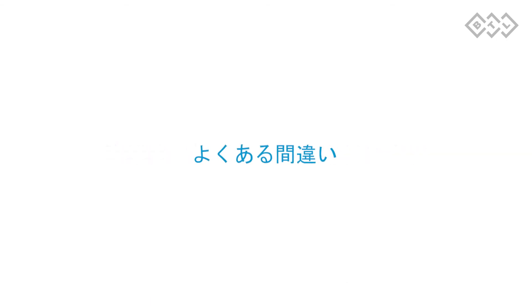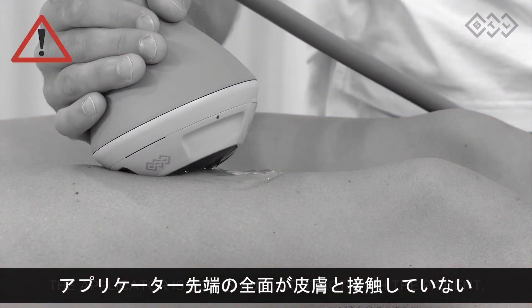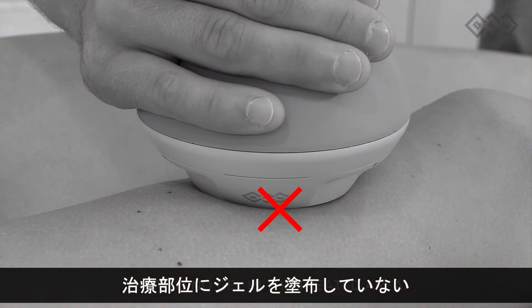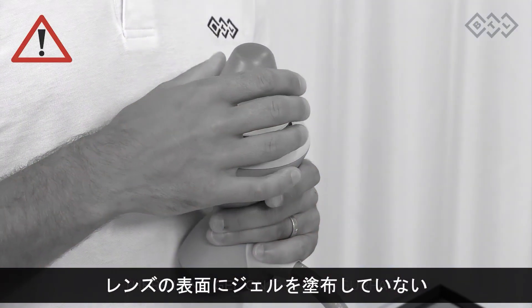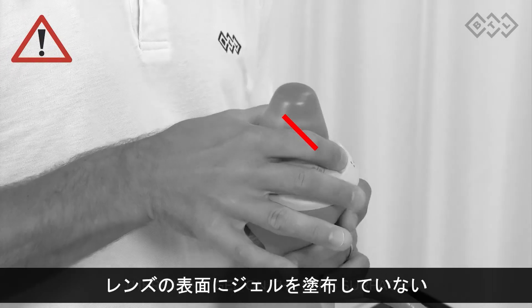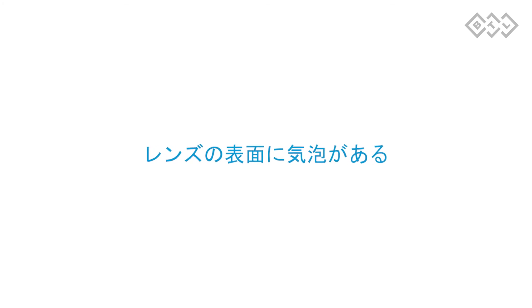Check out the most common mistakes to avoid. The applicator is not in full contact with the patient. There is no gel in the treated area. There is no gel on the lens surface. The air bubbles were not eliminated from the lens surface.